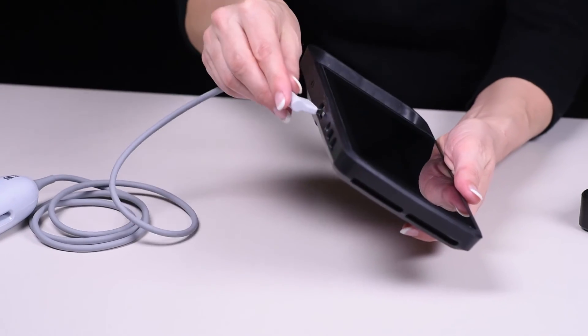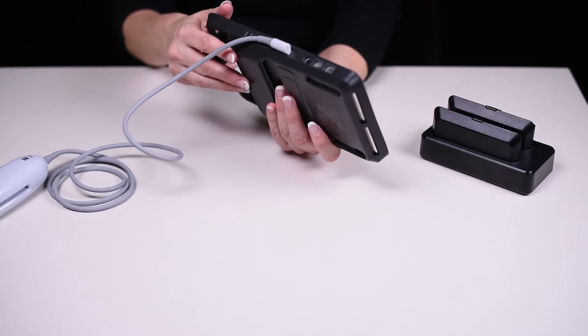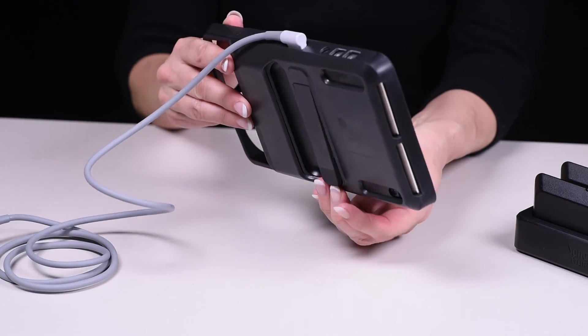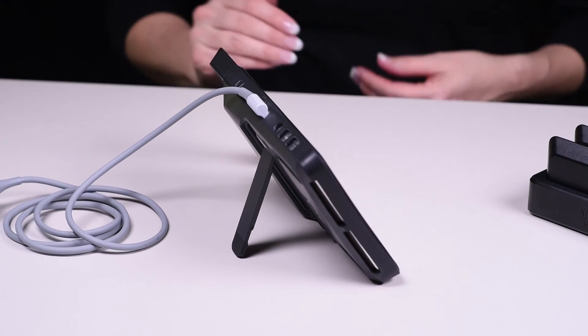Next, plug in the transducer. On the back of the case is a retractable kickstand. If desired, you can flip out the kickstand to place the system on a flat surface.